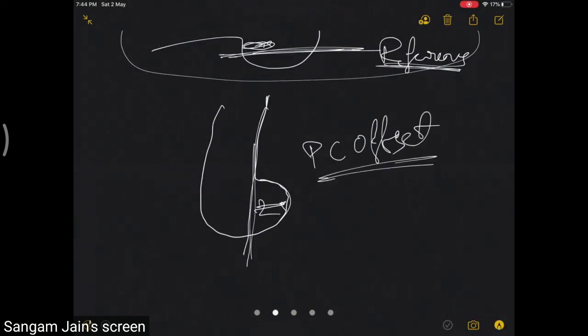And it is observed that you have to get back to this preoperative posterior condylar offset to have more range of motion, or to simulate the rollback of the preoperative situation.